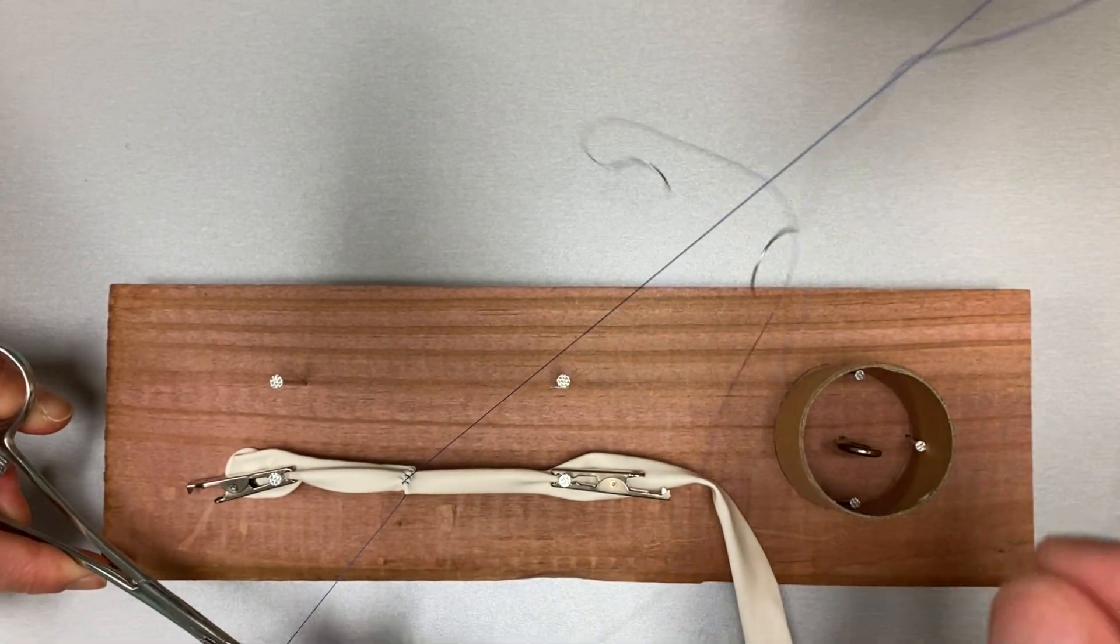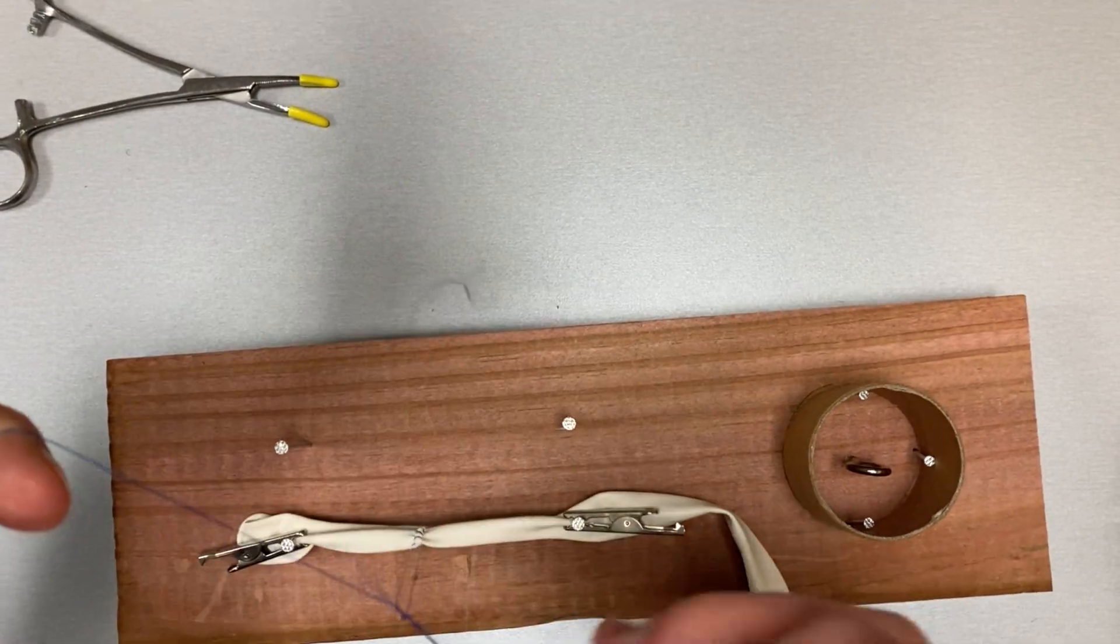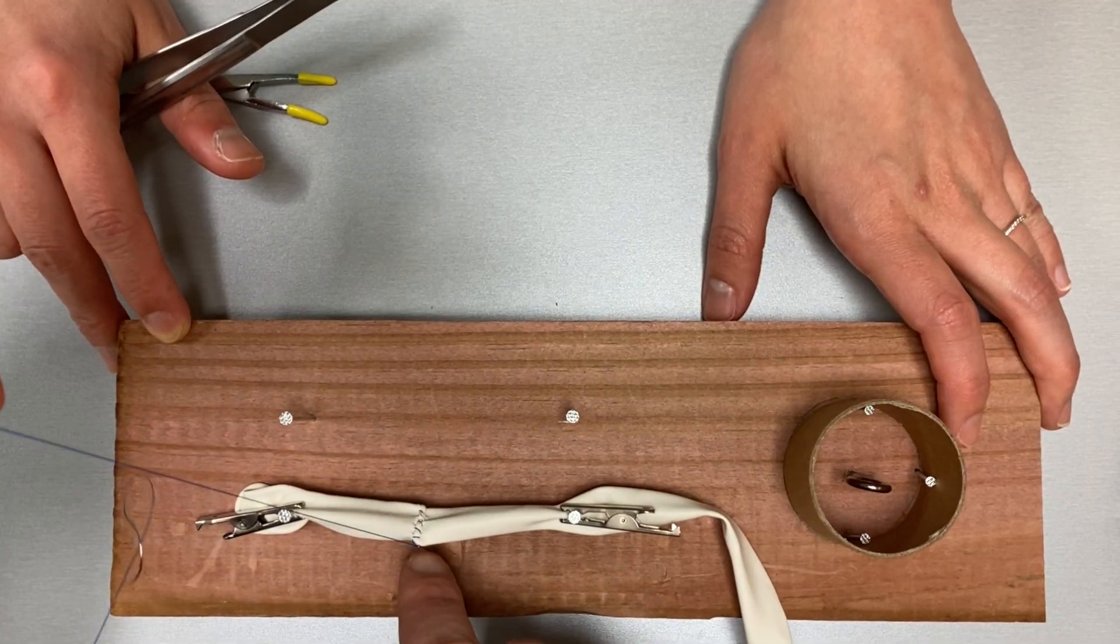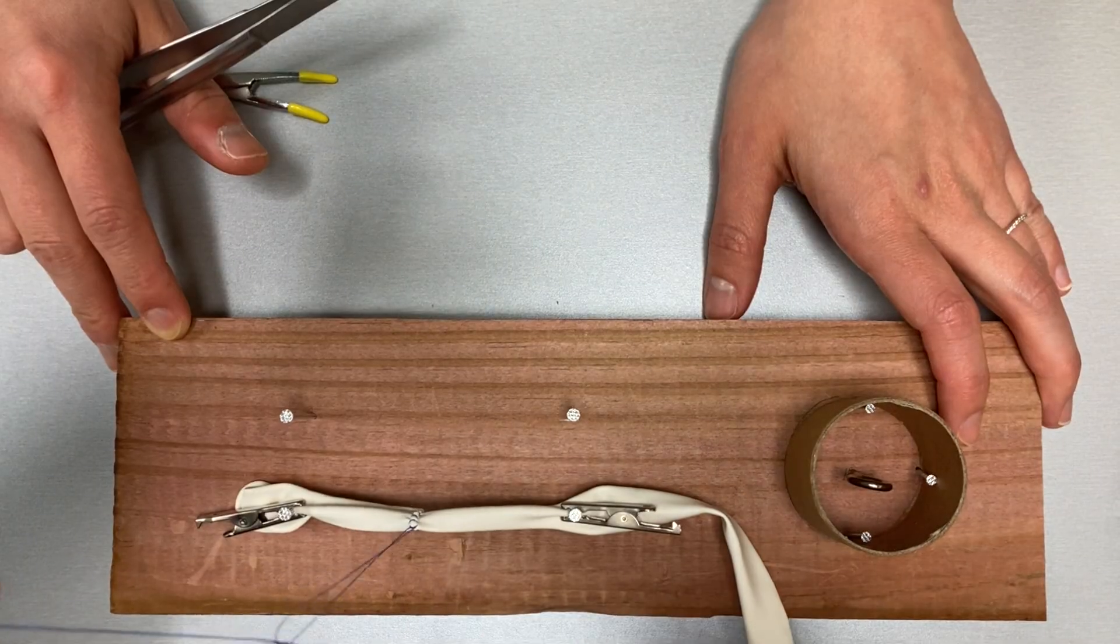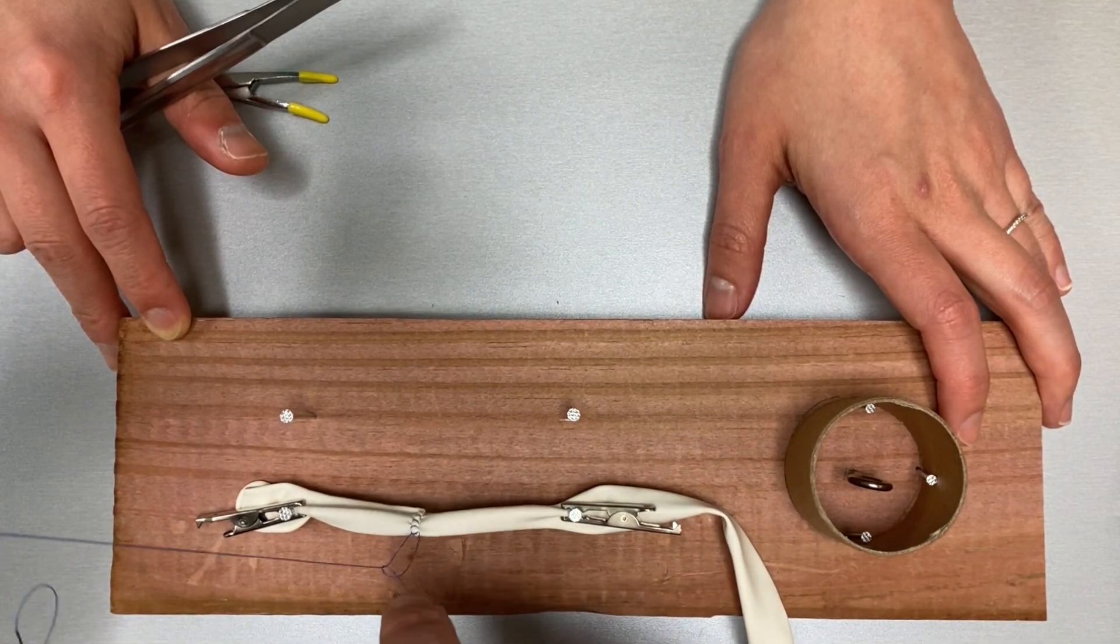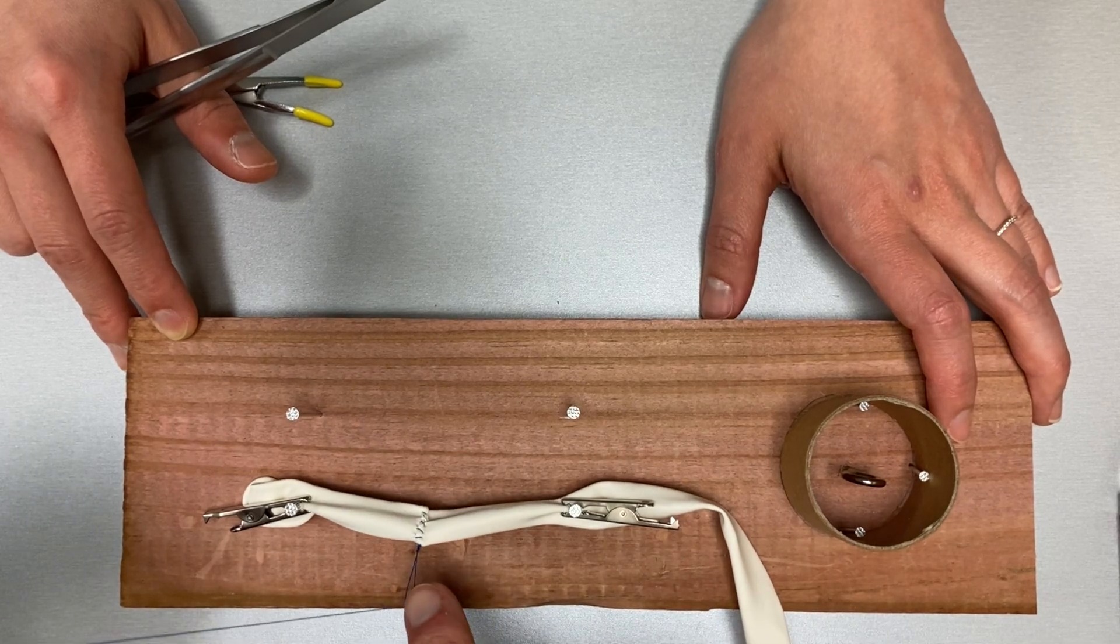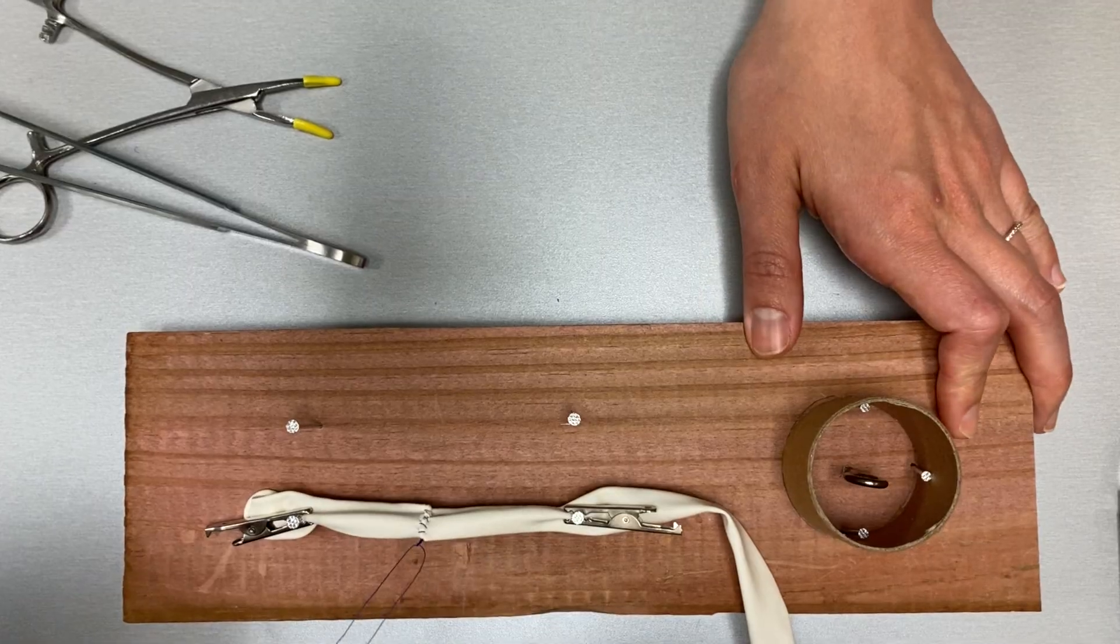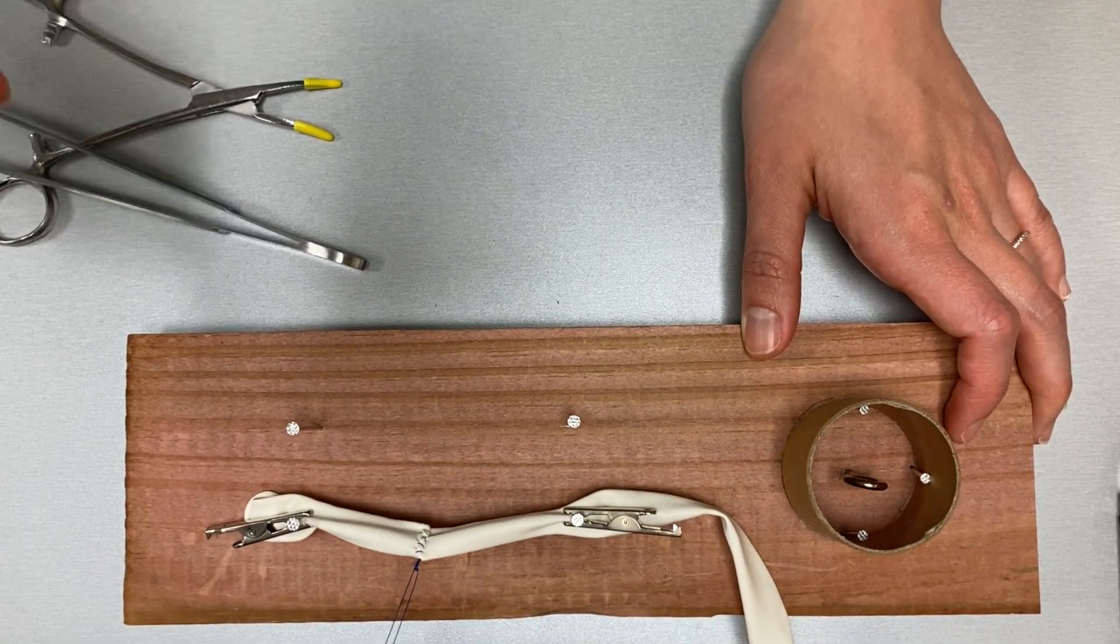After taking your final bite, tie both ends of the suture together using square knots. Cut your suture leaving a tail and your end-to-end vascular anastomosis is complete.